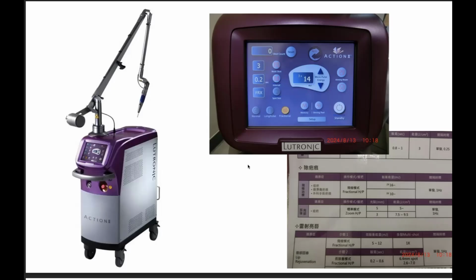The module is 3 fractional with energy of 14 millijoule. In this energy, it depends on the patient response. Okay, next slide.